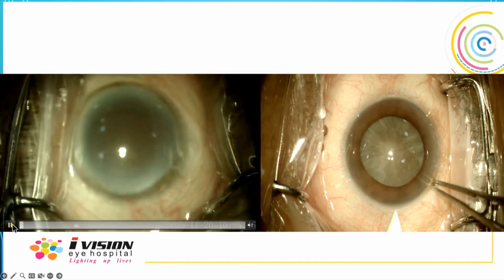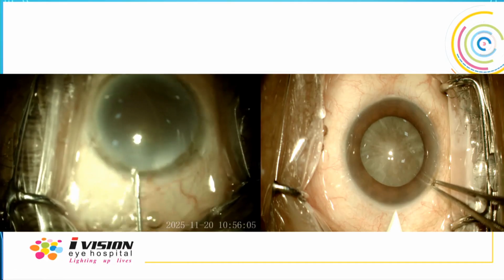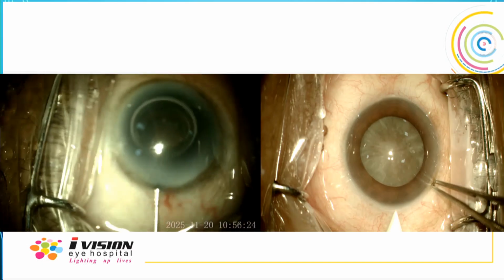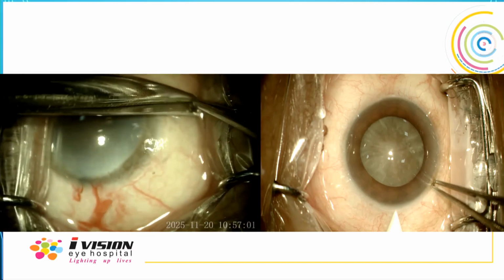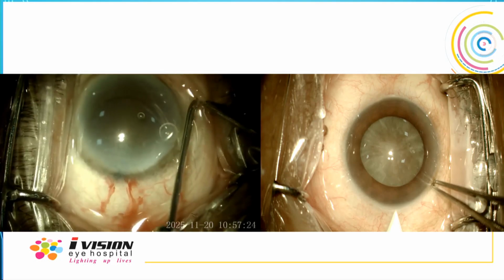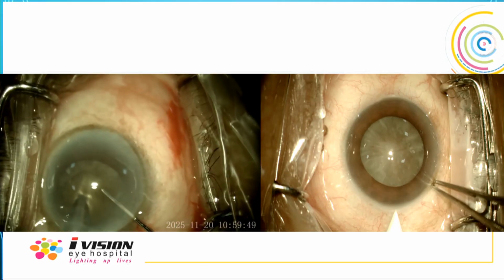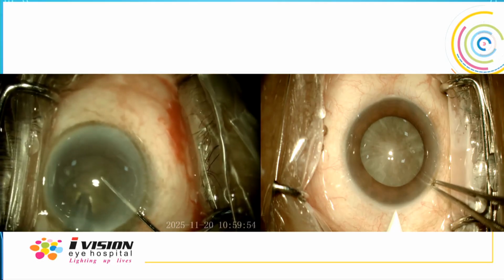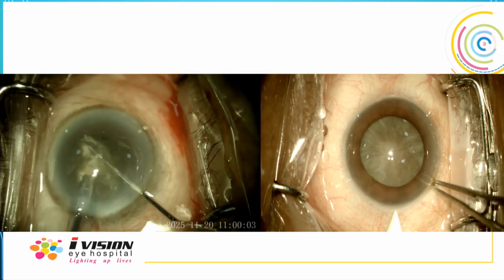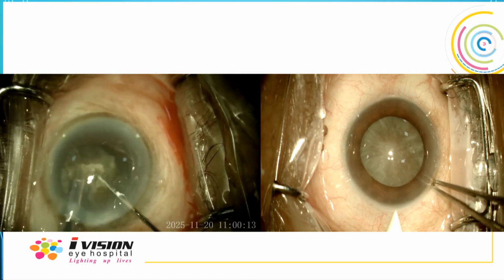As this was an elderly patient, cornea is not that clear, pupil moderately dilated, he was not cooperative, and a hard cataract. So I decided to convert, I'm planning to give subtenon. Learning subtenon is a very good thing, that at any stage of your surgery, like when you do topical, you can convert at any stage of surgery. And this is a very hard cataract. I have not emulsified deep, and my cracks are very superficial, as you can see. I haven't cracked the posterior plate.